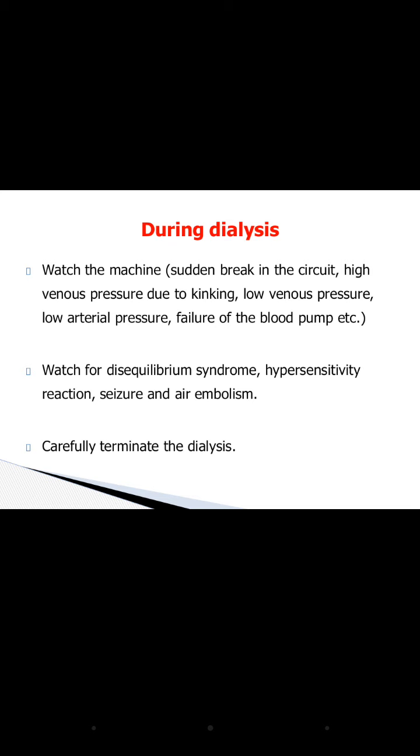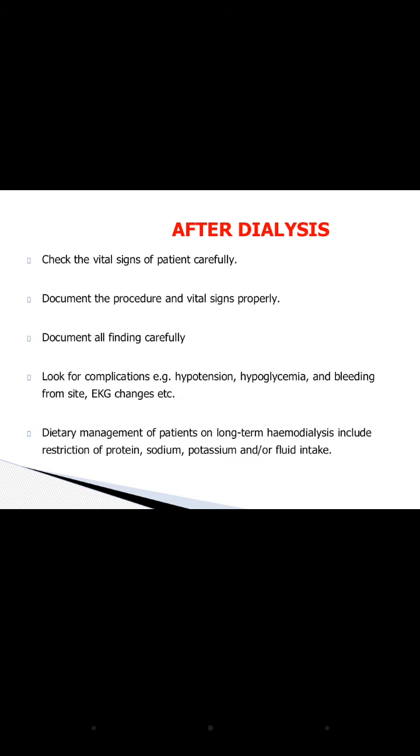Carefully terminate the dialysis. After the dialysis, check the vital signs, weigh the patient, and document the procedure and all findings. The findings include when the dialysis was started, when it was stopped, whether any medication was given during the dialysis, and whether any complications arose during the dialysis or not.